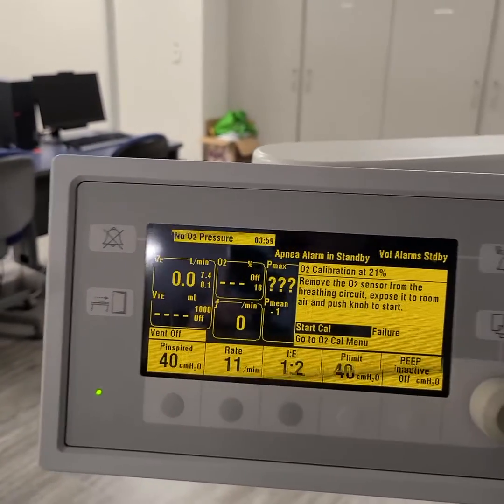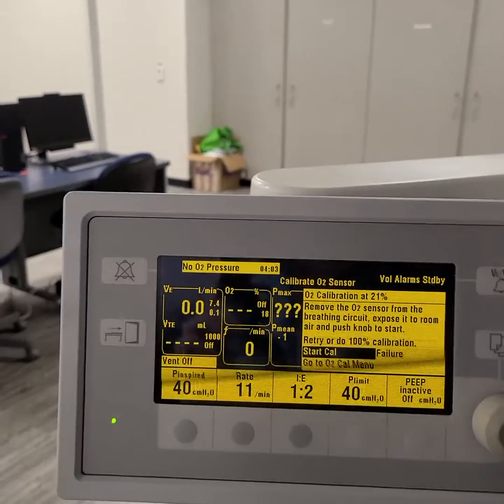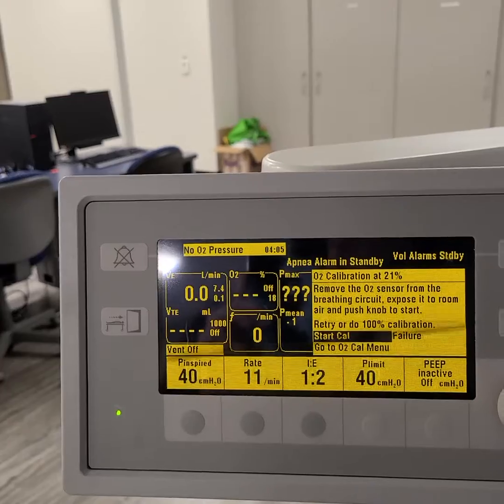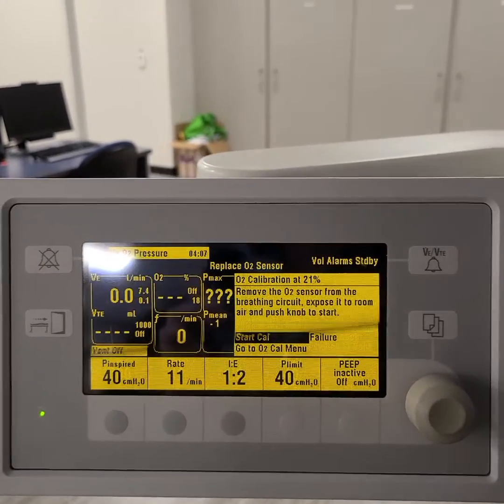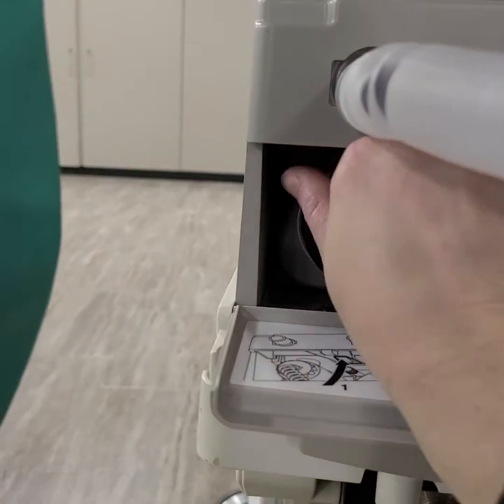And it failed because we don't have anything hooked up like we should. But if it was correct, it would have calibrated, succeeded, and we'd put this back on.